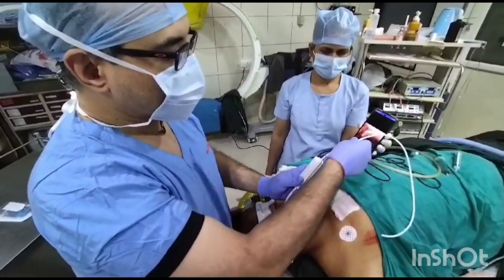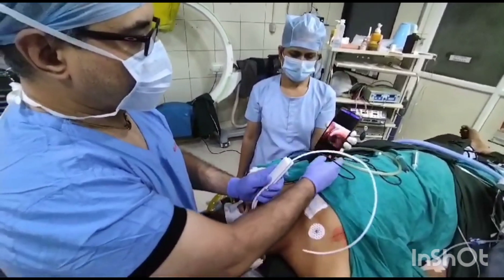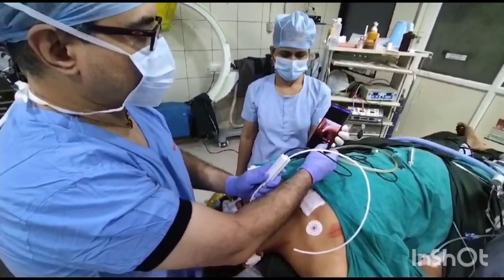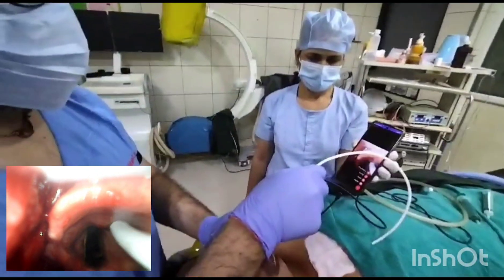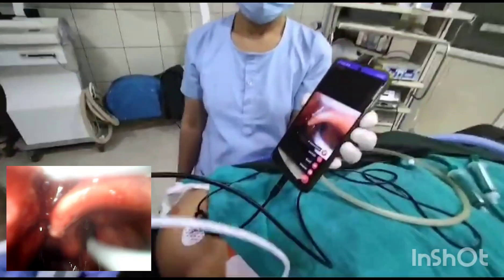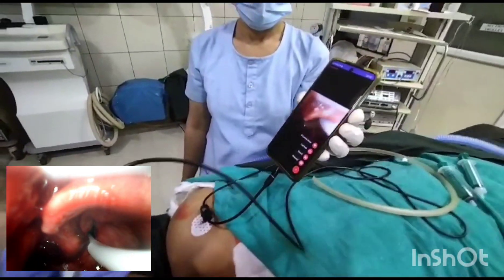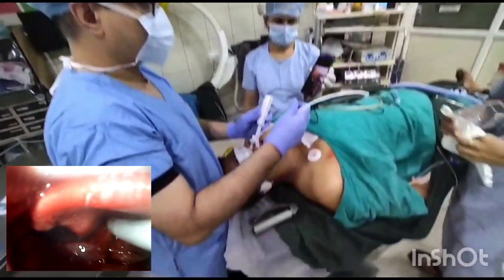Now I am inserting the bougie inside. We will also record the intubation. The bougie has entered. The patient is still not fully relaxed so he is moving. Now due to the muscle relaxant taking effect, we can proceed.